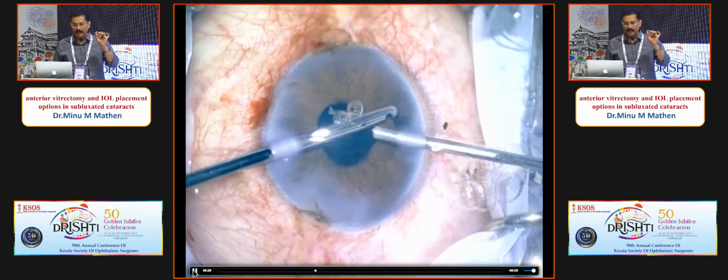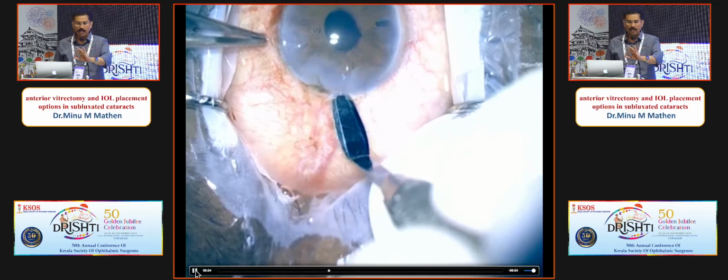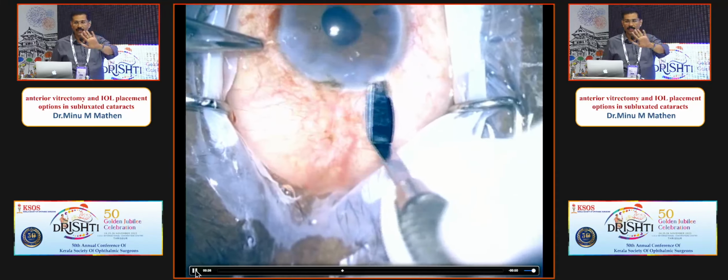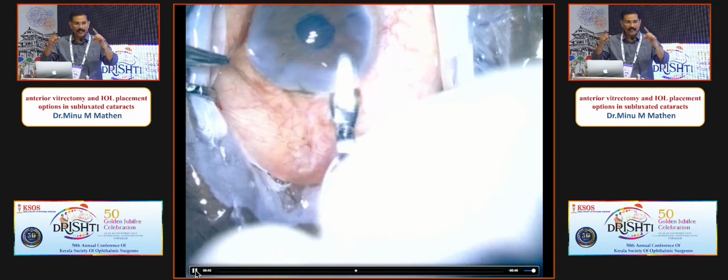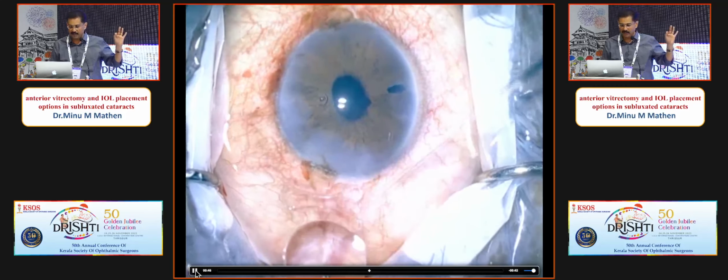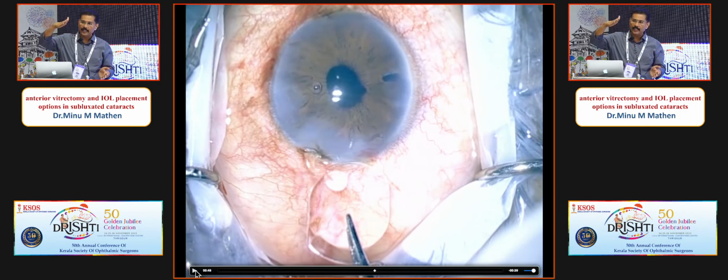So you have your lesser cut rate and use your vitrectomy probe itself. Extending on the cornea 5 millimeters is not the right thing to do. So please cut backwards into the sclera and then make scleral pockets and extend, or go to a different location, abandon this corneal incision. And the lens always comes with the angulation facing down in the package.